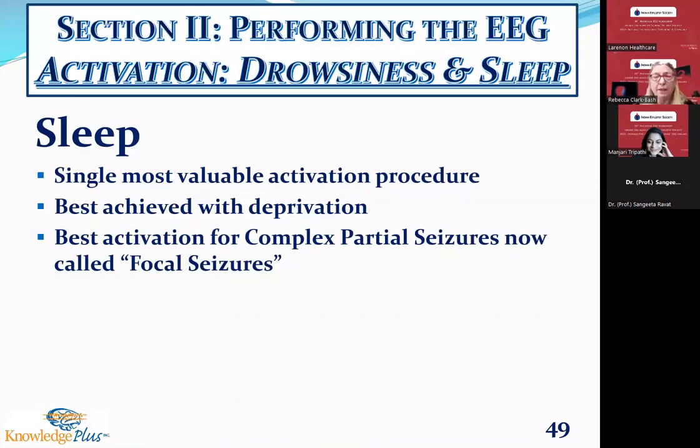Now, once inside my room, as I'm getting ready, I explain everything that's going to happen, the deep breathing exercise, the flashing lights. And the last thing I say is after the deep breathing exercise, after about 3 minutes, I'm going to come and help you get into a position of sleep. I don't know about y'all, but I don't sleep lying on my back like this. I sleep on my left side, cuddled up like this. If I am not in that position, I tend not to go to sleep.